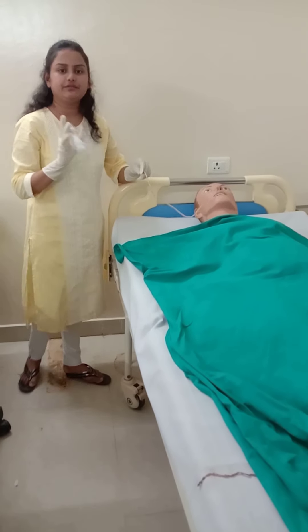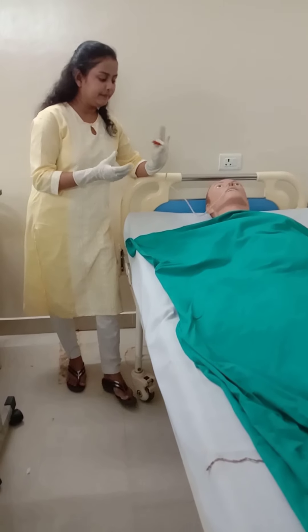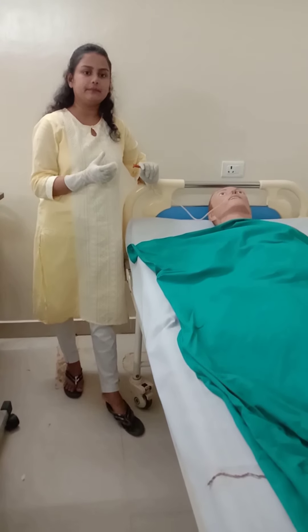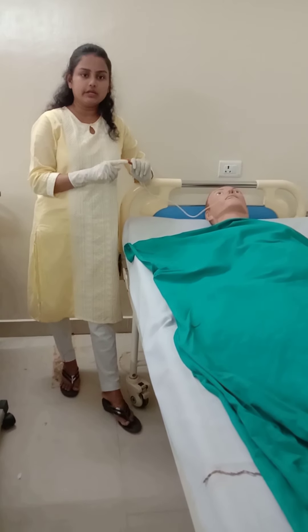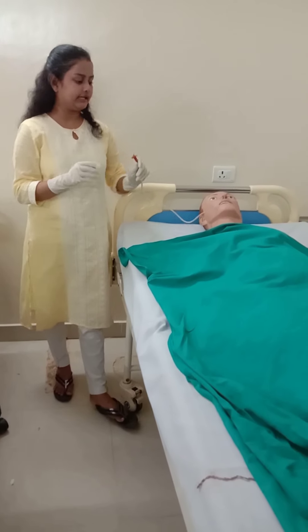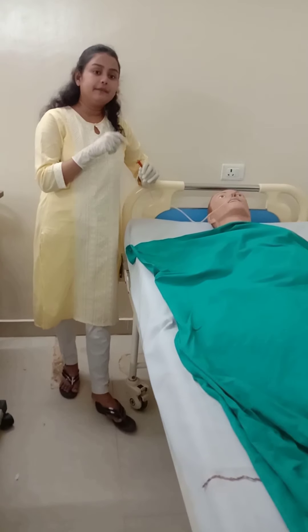This is the first technique. The second technique: take a bowl of water and place the free end of the tube into the bowl. If there is bubble formation in the water, the Ryle's tube has been wrongly inserted — it is in the trachea. If there is no bubble formation, the tube is in the stomach. The third technique is to aspirate gastric content.